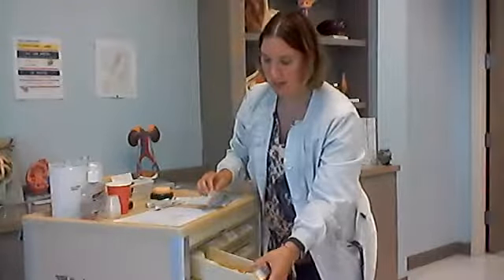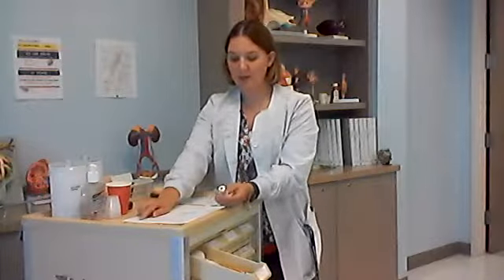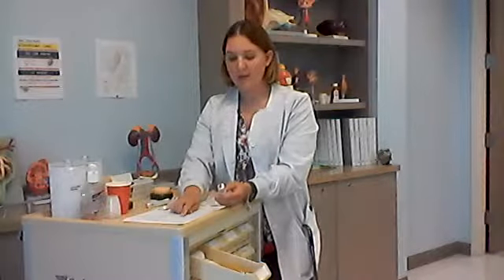Here he is. I'm going to do my first check as I pull the medication out of the drawer and set it on my workspace. So I'm going to start with my heparin. Here is Mr. Walker's heparin. I'm going to do my 6 rights as I check. So Terrence Walker, 15461. Heparin. Now this says I need 5,000 units, and this says it's 10,000 units per milliliter.